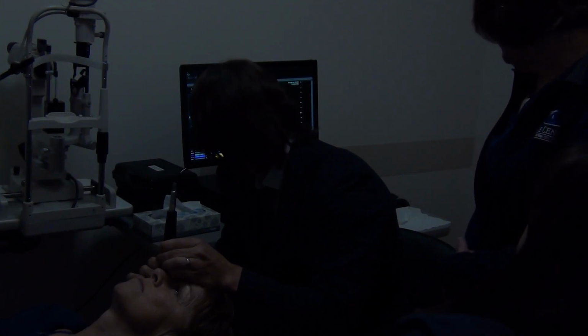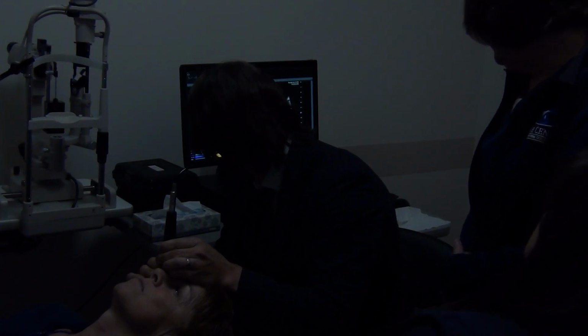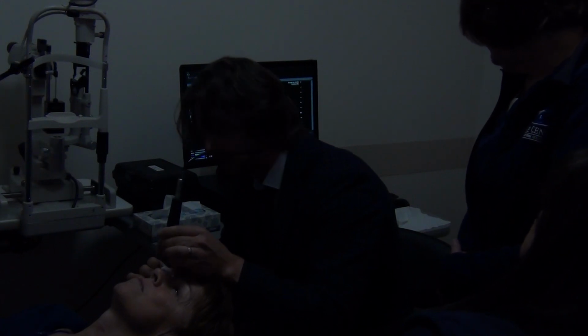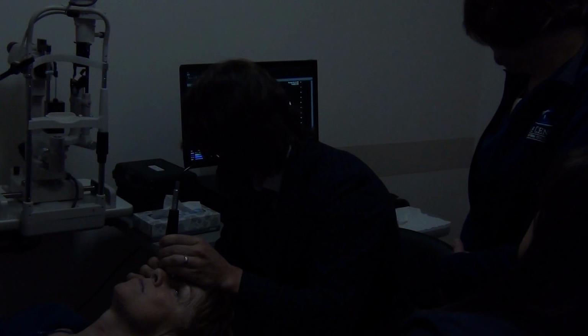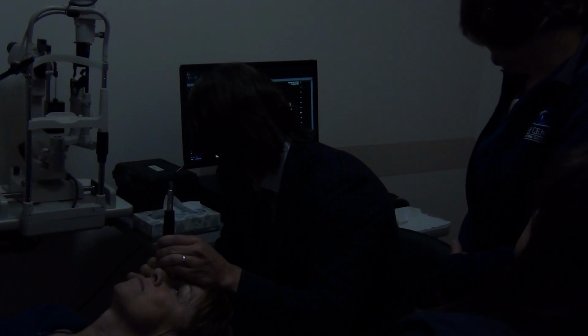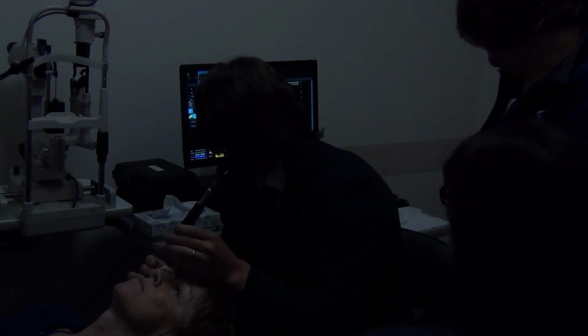I'm looking for the cornea, the front of the lens, and the back of the lens, which is very important. Then the unit starts building up all those lines for me, and I need to make sure that they are as straight as possible.